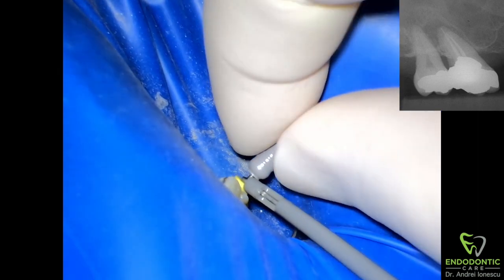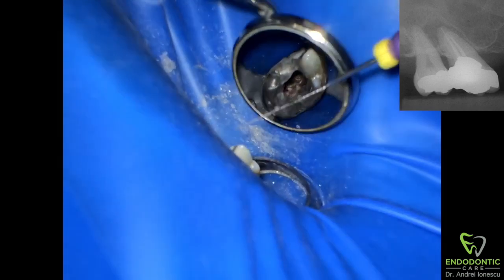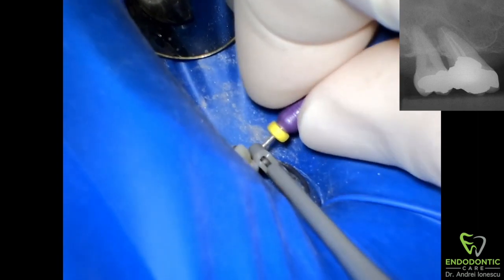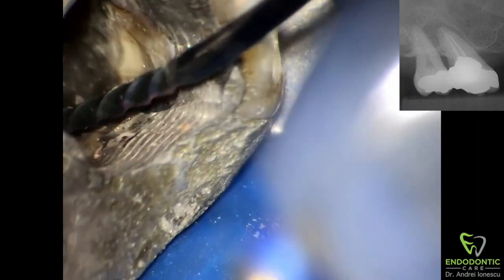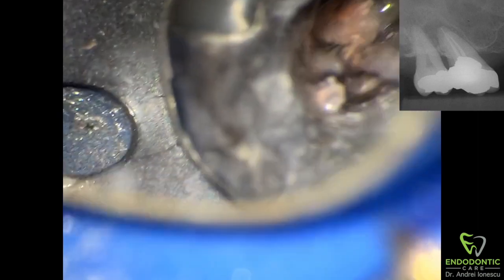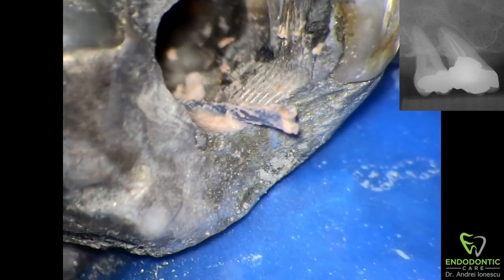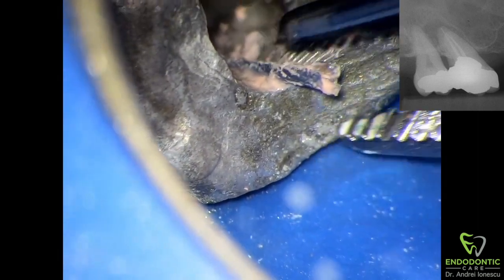Now I'm just confirming that I'm at working length. I try to get an early estimate of the root canal length so that I'm not passing through the apex and extruding debris if possible. Sequentially working the canal a little bit larger — now with a 10K file — and shortly after switching to rotaries. This is a 30, 04-taper rotary file, and inserting it into the canal along the thermofill, it just pops out. We got lucky in this case because that carrier was small and there was room around it, so as soon as the rotary went in the thermofill carrier came out.